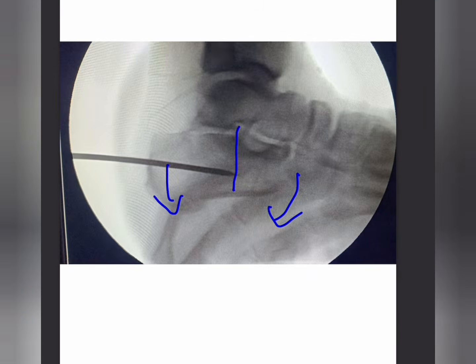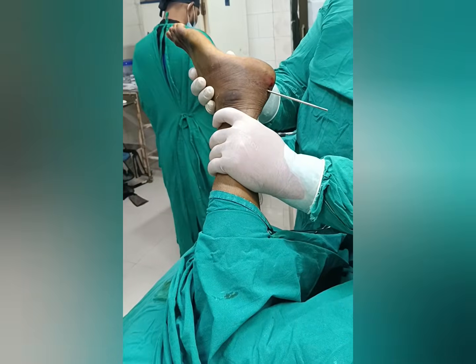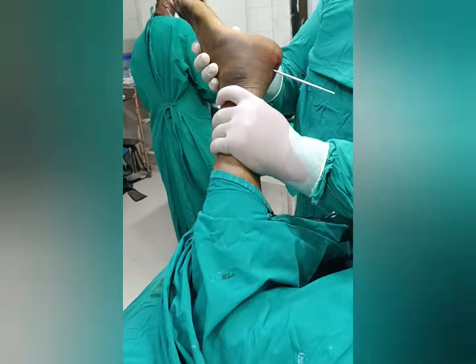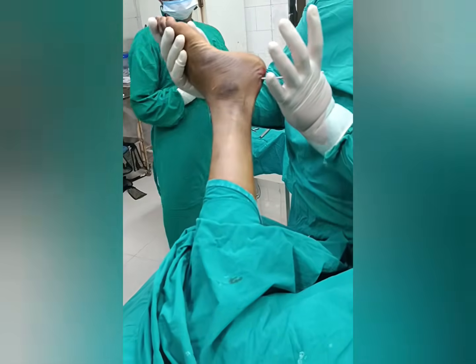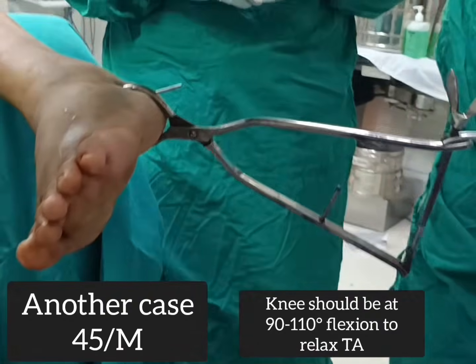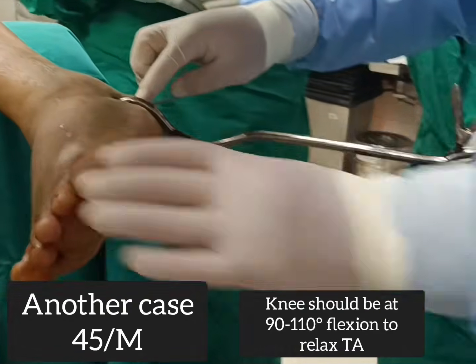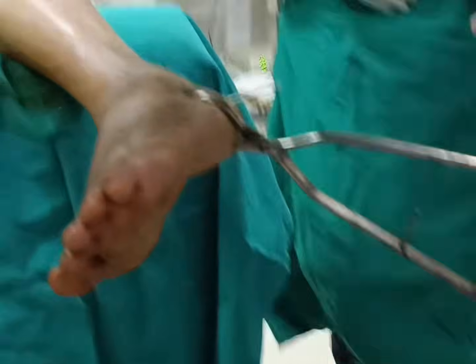Now we'll shift to the OT to check how we reduced with the Essex Lopresti maneuver. Okay, flex to 90 to 110 degrees. Between 90 to 110 degrees the knee is flexed, the knee is lifted off the ground, and then we perform the Essex Lopresti maneuver. So we have passed the Steinmann pin at the calcaneal tuberosity. Okay, now we are going to perform the Essex Lopresti maneuver.